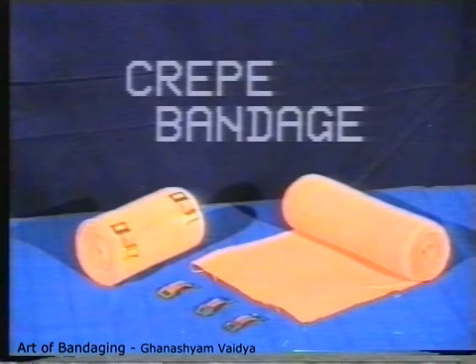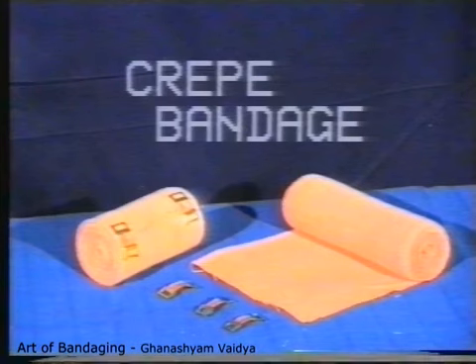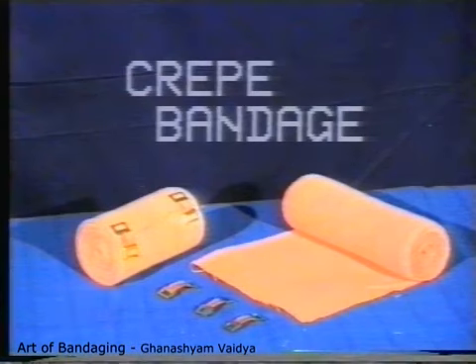Crepe bandage or elasto-crepe bandage is a woven elastic fiber bandage and has elasticity. It is used to provide pressure and support to sprained ankles or to reduce edema as in varicose veins. The elasto-crepe bandage can be washed, dried without squeezing and reused, but its elasticity reduces after reuse.